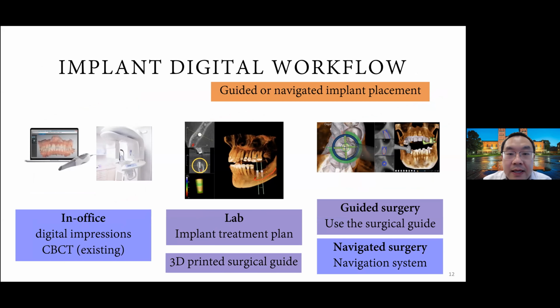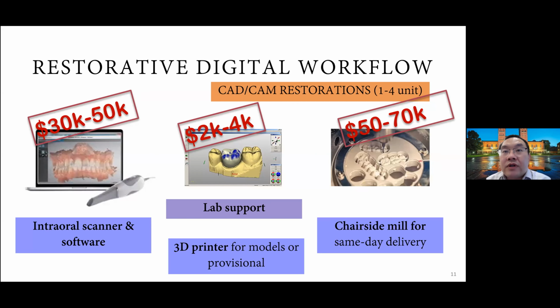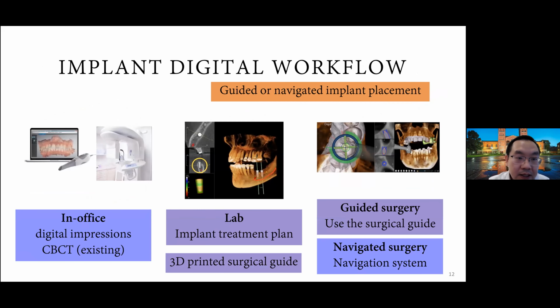And then let's talk about implants. All right. So first of all, restoring an implant can completely be done by the traditional restorative digital workflow. Everything is pretty much similar. You just scan in the implant as if you're taking the final impression, and there is a scan body. That takes the place of the impression coping. So you scan in a scan body, and the rest of that, basically the lab can do the design work for you. Okay, so that part is not difficult.